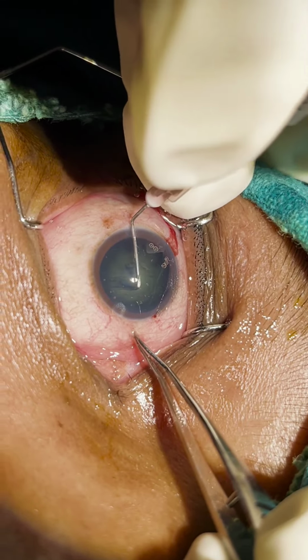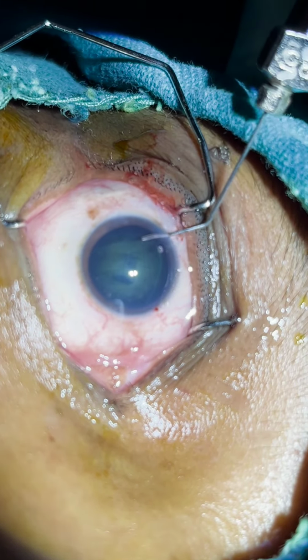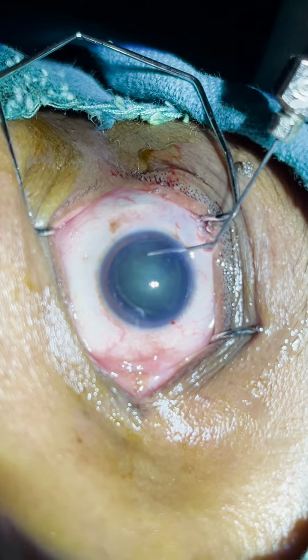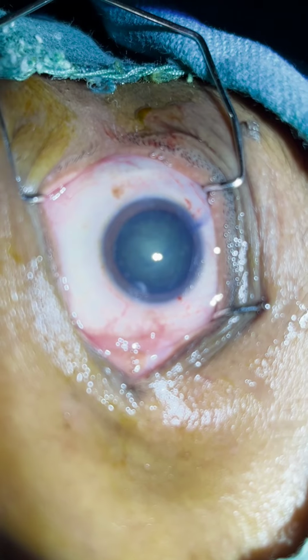It is a soft case, so we'll try to do a direct chop. Usually I do direct chop for all my cases, but if I don't get a grip, then for softer cases we proceed with flip and chop.